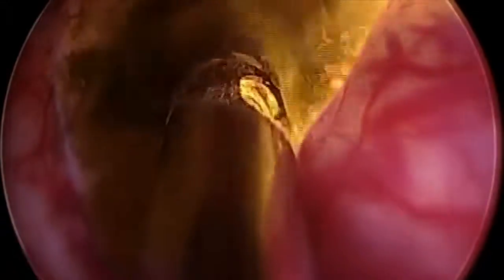If we had bleeding going on, even just a little bit, it clouds the vision and makes this procedure very difficult. That's why it's crucial for us to have a technology such as the green light that doesn't cause too much bleeding. It shortens the time you're under anesthesia and maximizes the time we have to get your prostate wide open.